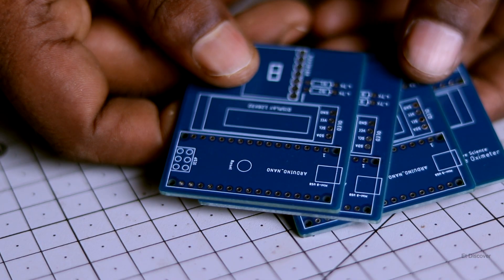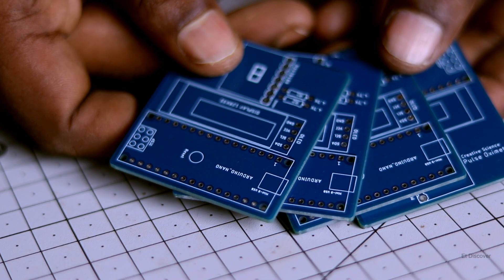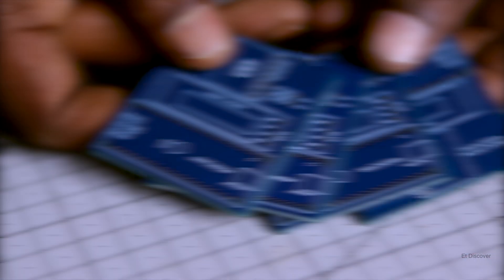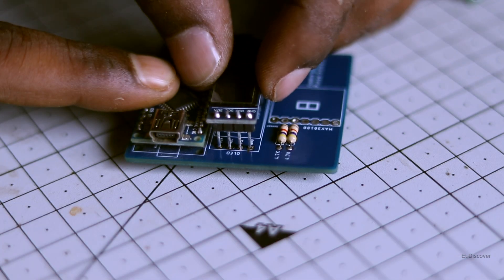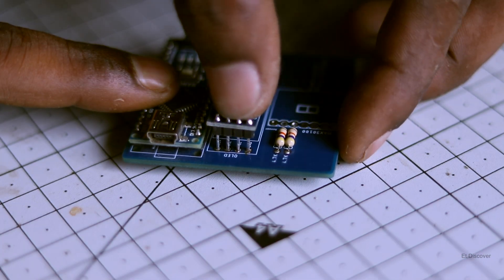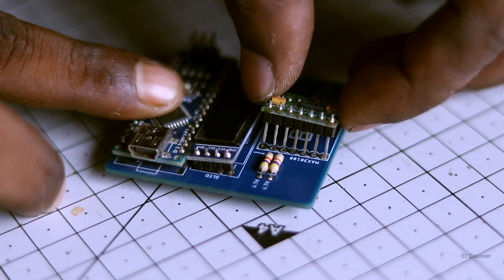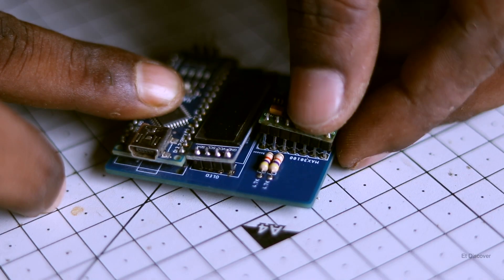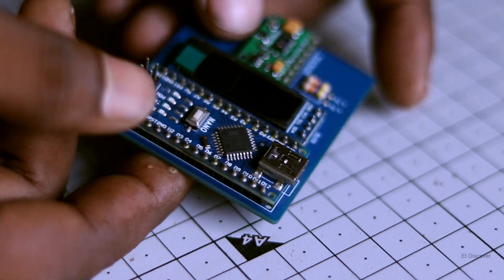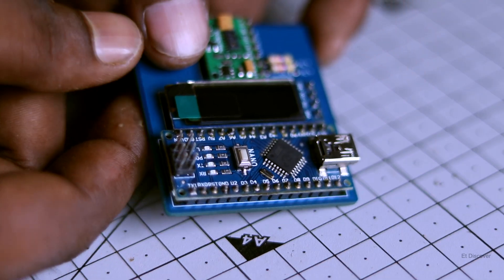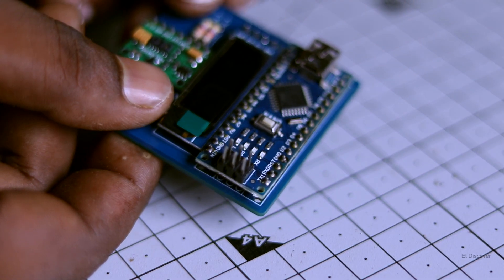This is really good and quite promising. Right? So next I put every component on this PCB. And after soldering everything, it looks like this. Not too bad, right?